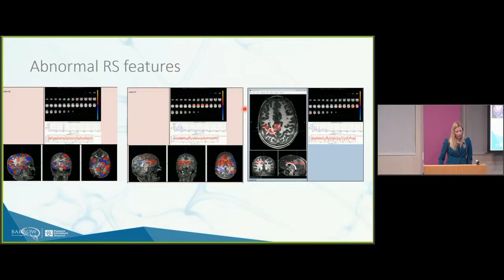But at this point in time, these are also seizure sources that were detected. When I saw this child, he was no longer seizing on the EEG, and he had pupils that were in and out of responsiveness. And I did deliver this news to our care team and sort of left it to them to decide what they should or shouldn't tell the family of this objective information.